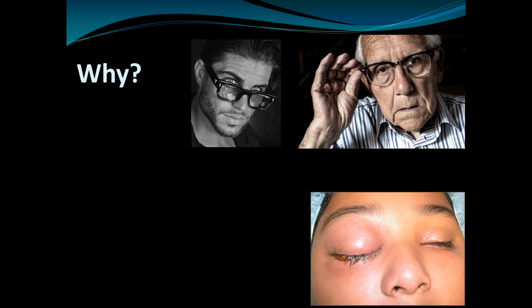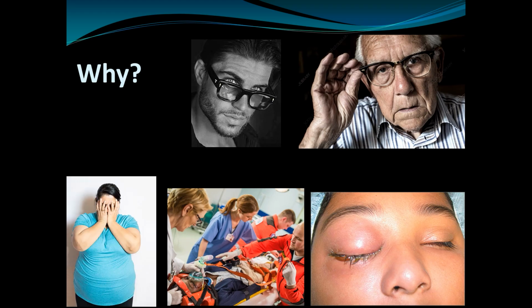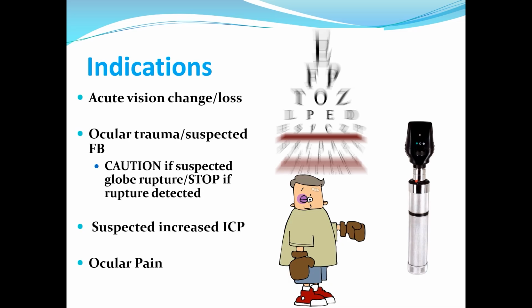And here's an example of ocular trauma. We don't really know what's going on behind that eyelid, and it would be really hard to prop it open. You might have a bunch of trauma patients, and you might want to know if somebody has increased intracranial pressure, which we can actually tell by ultrasound. And if you have someone with a really bad headache and you're thinking about IIH, you might want to use ultrasound to take a look at the optic nerve. So basically, if you're having trouble seeing, if you have eyeball trauma, if you can't get there with your ophthalmoscope, those are the things that we would want to look at using ultrasound.